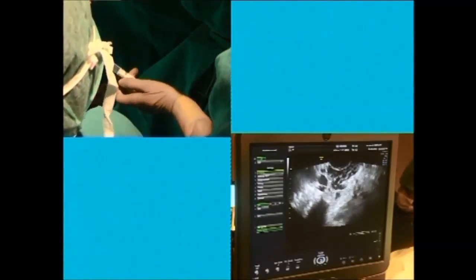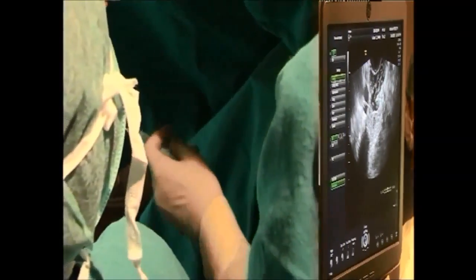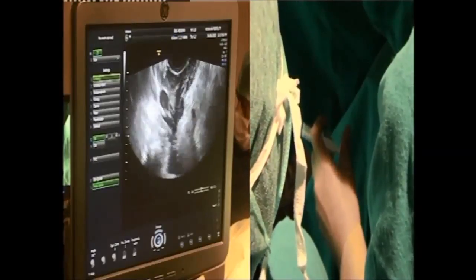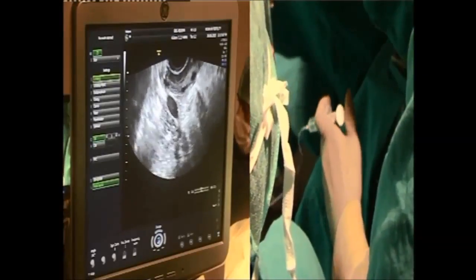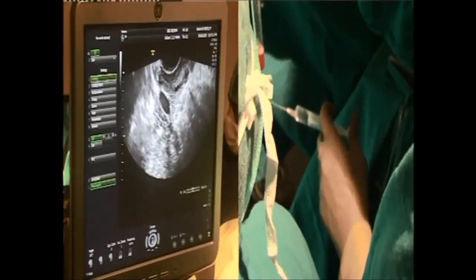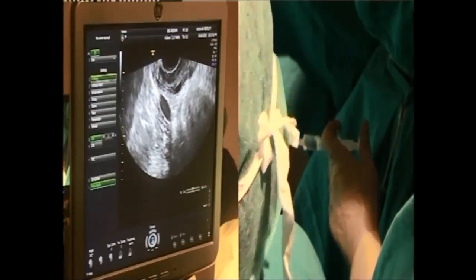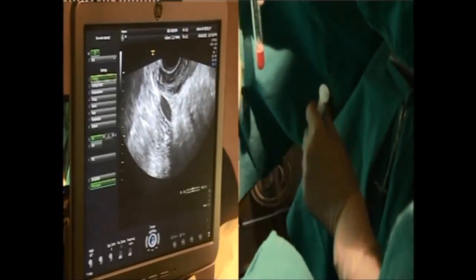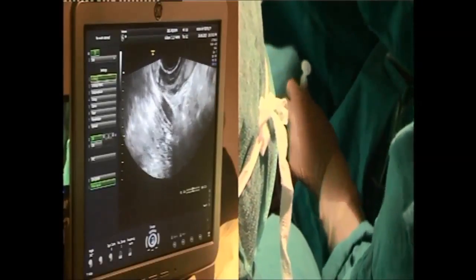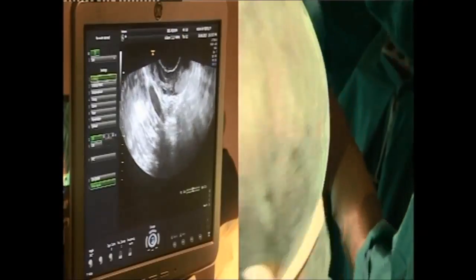Push the fluid at that same point without withdrawing. There's some fluid that's come up — it's 2ml — it's supposed to refill the follicle. Then you suck back the same fluid, so that if the egg is stuck at the periphery of the follicle, it's washed out completely.